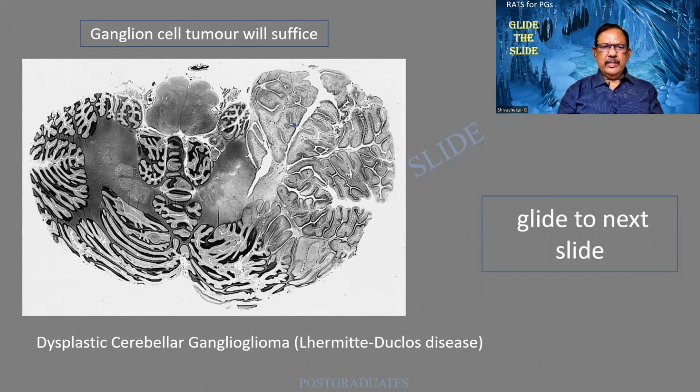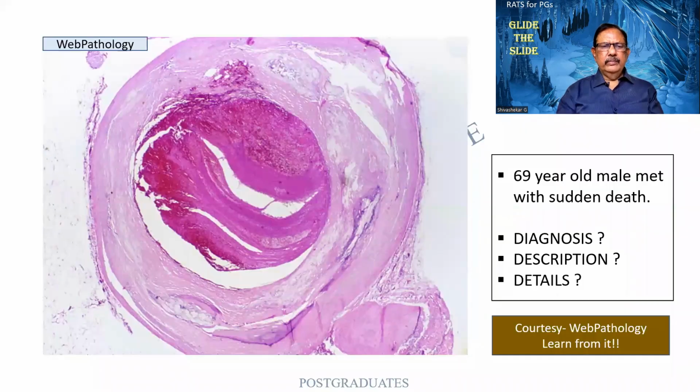The next slide is, thanks to web pathology, a 69-year-old male who met with sudden death.